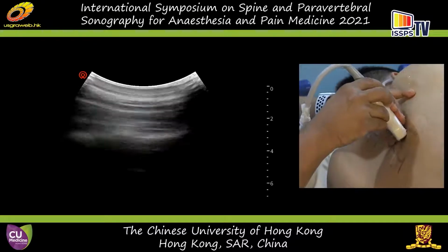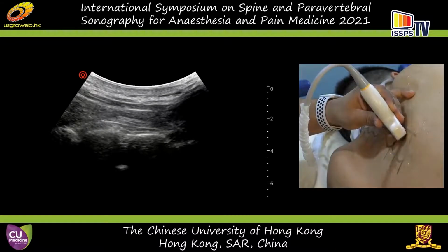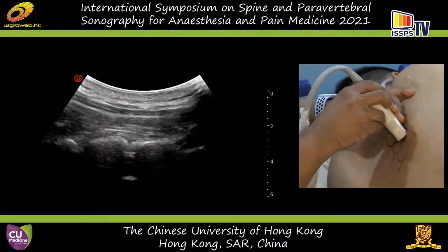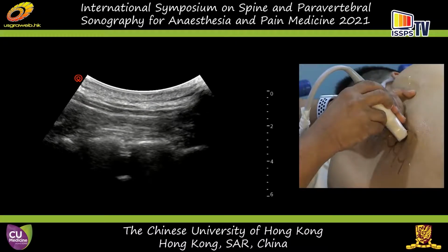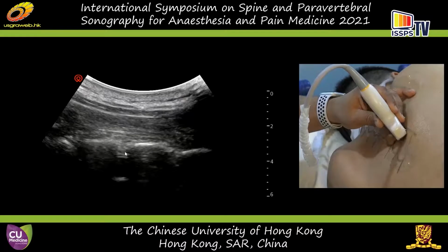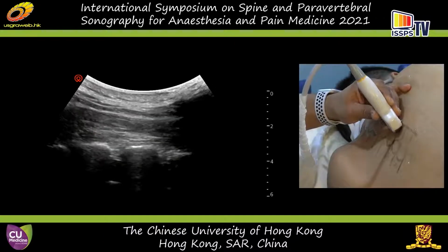So if I were to perform a scan in this individual, you can see this level is quite good. You can reduce the depth, please, improve the magnification. Yeah, not too much. That's good. So you can see here, in fact, now you can indeed see the epidural space very clearly. It's a very narrow space, but nevertheless, the epidural space can be visualized with a thick ligamentum flavum behind. Let's look at the space above. You can also see the posterior dura, the ligamentum flavum.